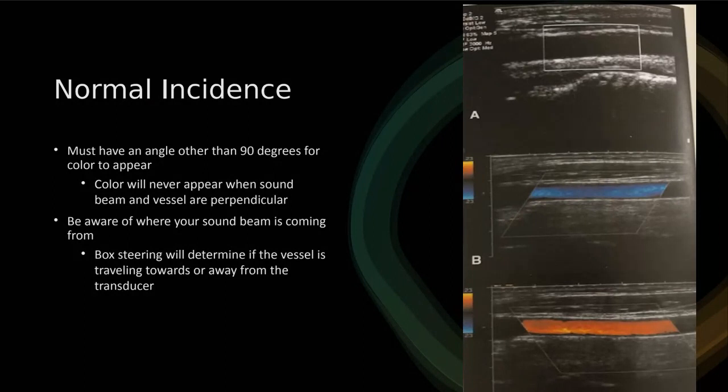Today it's more about how I optimize that and make it the most accurate that I possibly can. So we learned about all of those different angles last week. We learned about cosine last week, right? We don't want anything coming in perpendicular because the cosine of 90 is 0, so we're not going to be getting accurate velocity representation when we're using our Doppler. So when we have different degrees of incidence, if we remember this from the mid-semester mark, we want to be coming in at different approaches so that we can line everything up as well as possible.